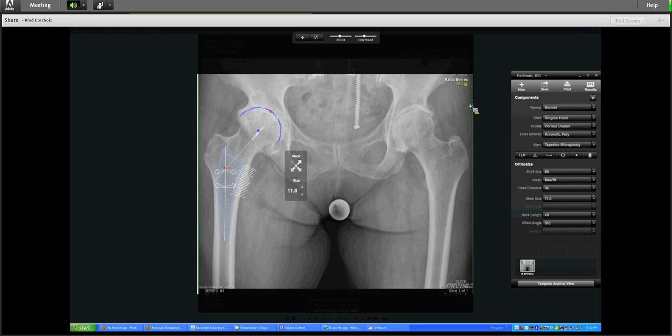There's a couple of tools as well that I'm not going to, again, profess to know all that orthopedic surgeons do, but let's say there are some minor tools in here. If we wanted to look at canal spaces, there's a measuring tool that I just clicked on, and I can measure the canal space, for example.